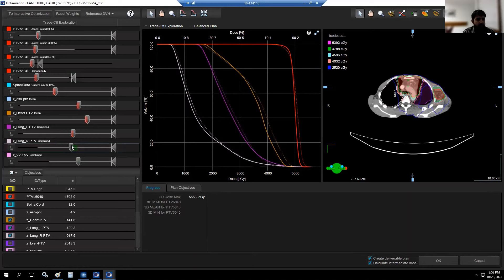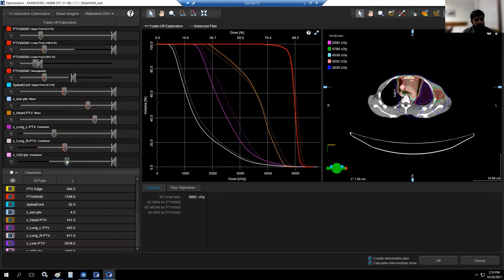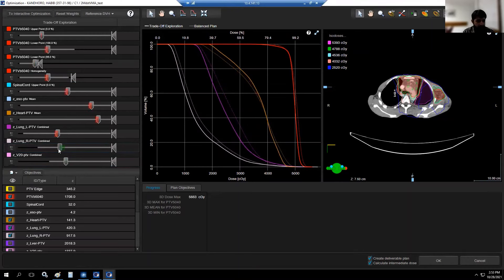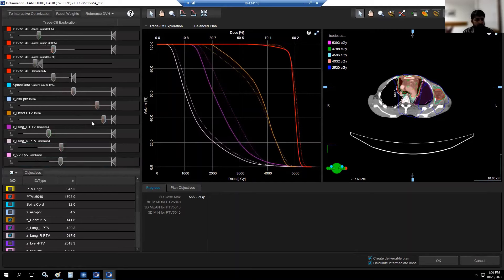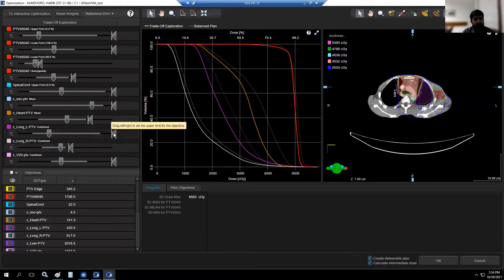Now I'll move the V20. The right lung is the healthy lung, so I'll try to move the right lung first. Here you can see the homogeneity is moving toward the right and the left lung is also moving toward the right. This is how you navigate to get the best plan out of what you have made.